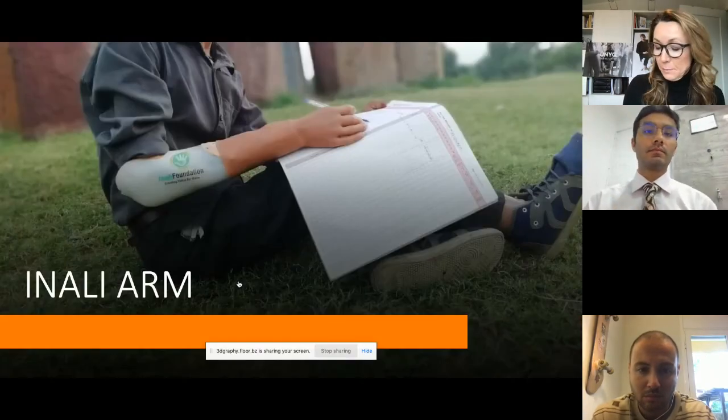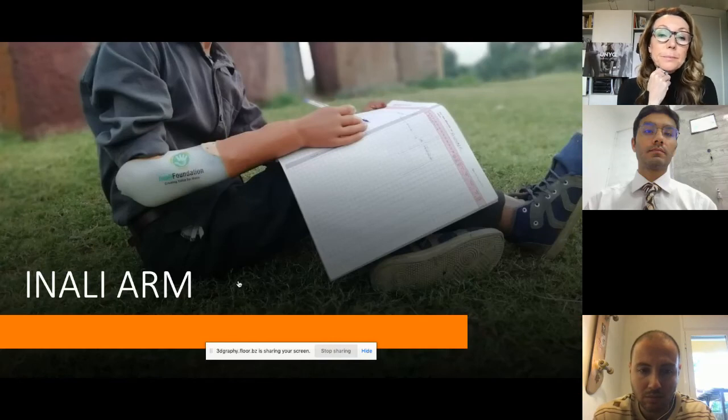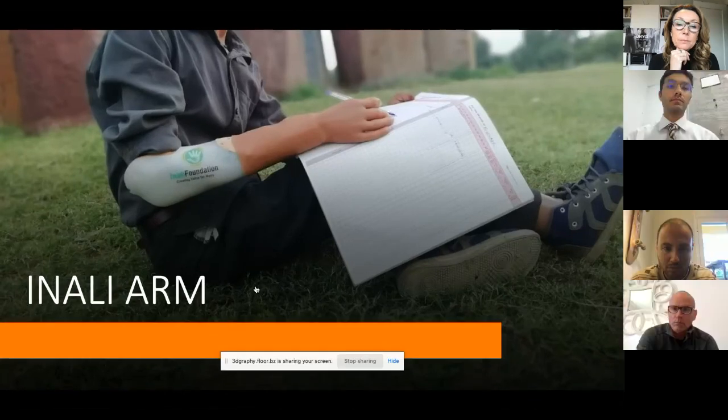So it's not completely 3D printed, but yes, it has 3D printing inside it, where we have the fingers molded with 3D printing. We have certain gears which are 3D printed. Apart from that, there is a combination. It's a hybrid version, I could say, with metal inside along with 3D printing. But more than that, we made it look more like a real arm in terms of aesthetics. You can see it is made out of these silicone gloves where a person can feel the nails. He can feel the skin. So the silicone gives more appearance like a real arm.